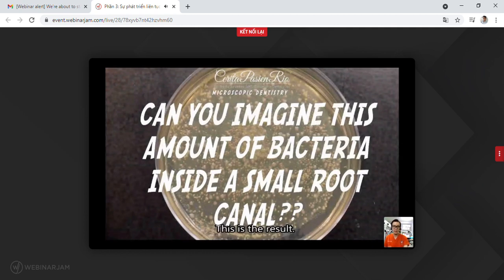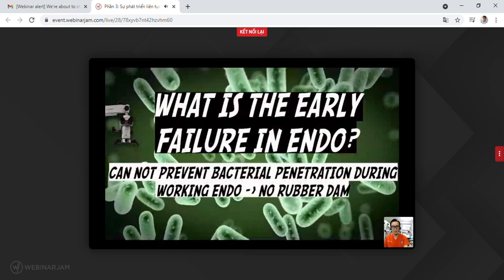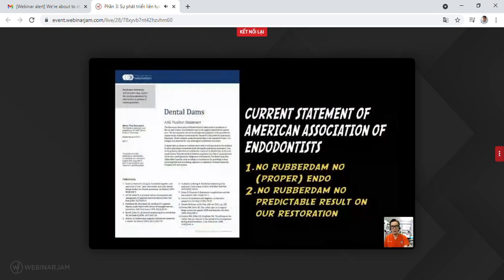Please, please prevent any possibility of reinfection during endo by using a rubber dam. So now, no rubber dam, no endo. This is not from me.